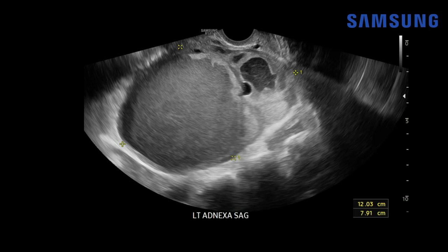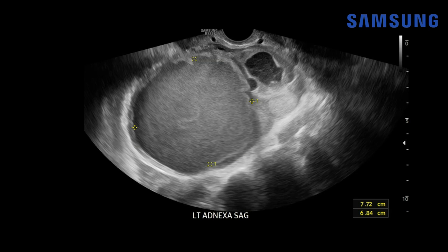Case number two: this patient had a history of an enlarging adnexal mass. Here we have a transvaginal ultrasound of the left adnexal mass and you can see the left ovary is quite enlarged, measuring up to 12 centimeters. This ovary actually contains two lesions — a smaller one and a larger lesion measuring about 8 centimeters — and notice that there are homogeneous low-level echoes diffusely throughout the larger mass.